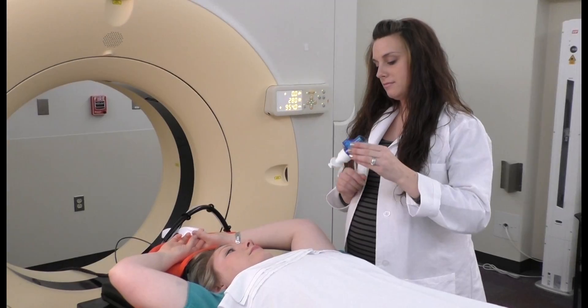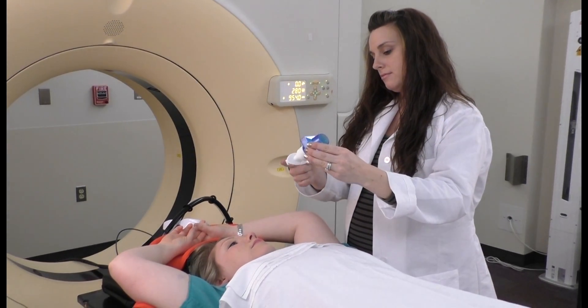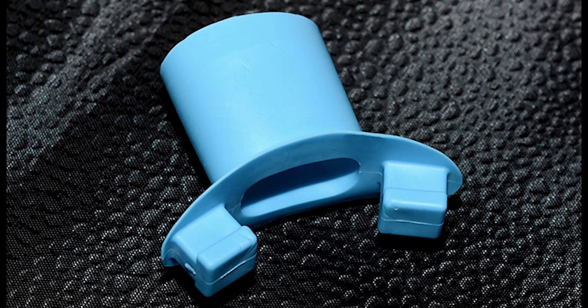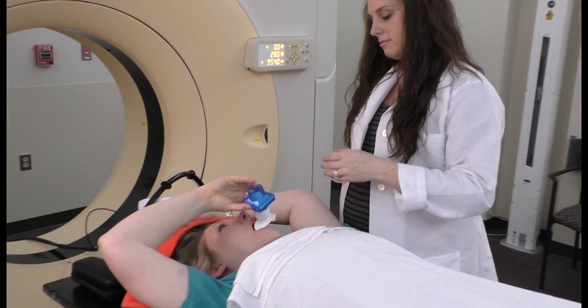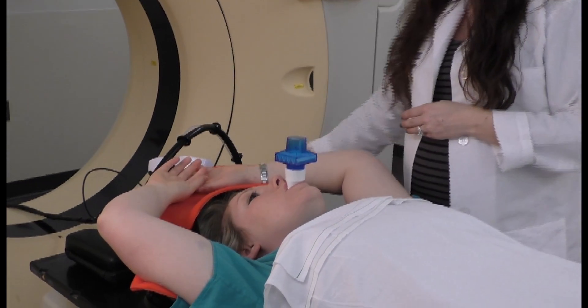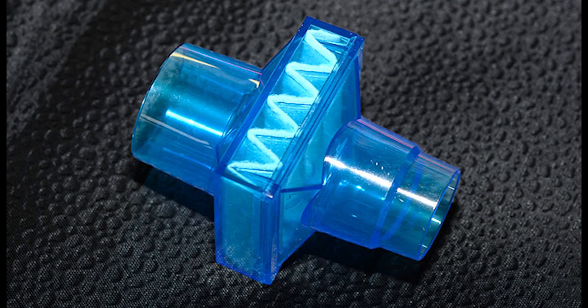Your therapist will first introduce you to the mouthpiece and bacterial filter. The mouthpiece is made of a soft rubber that looks a lot like a swimming snorkel, allowing your lips to form a seal around it so that breathing can occur through the mouth. The bacterial filter is attached to the mouthpiece and changed daily.